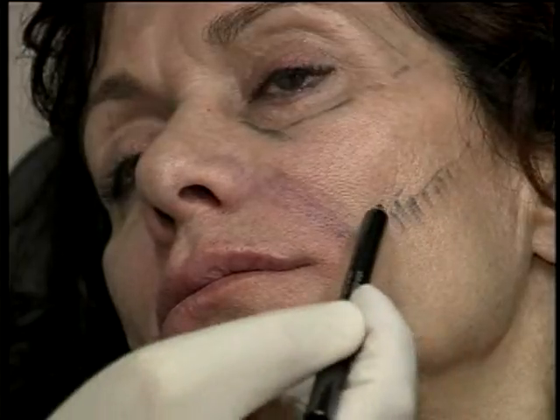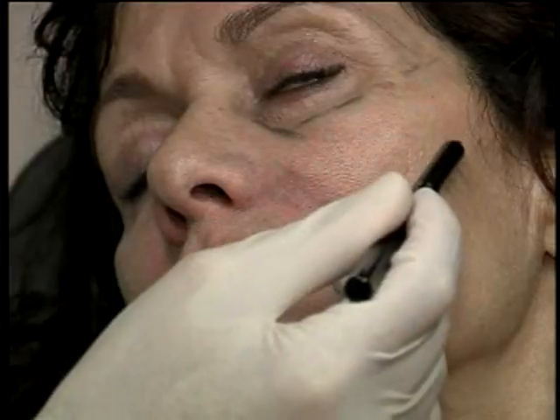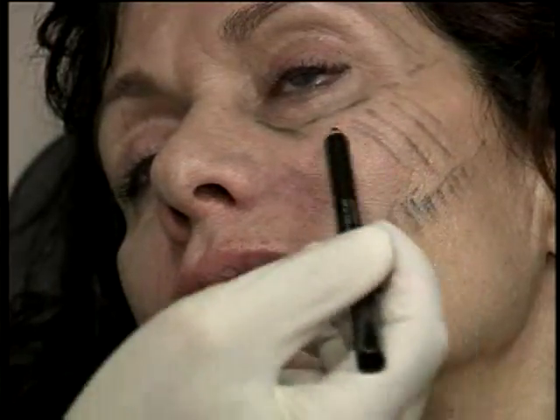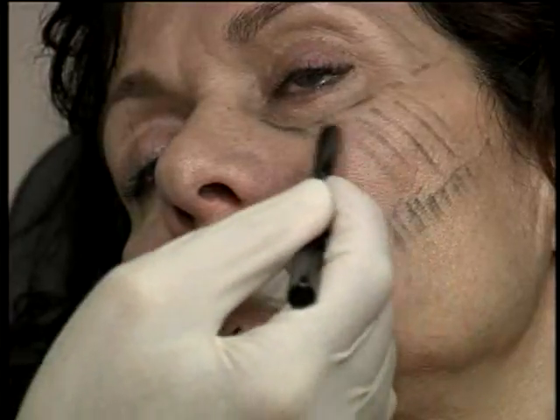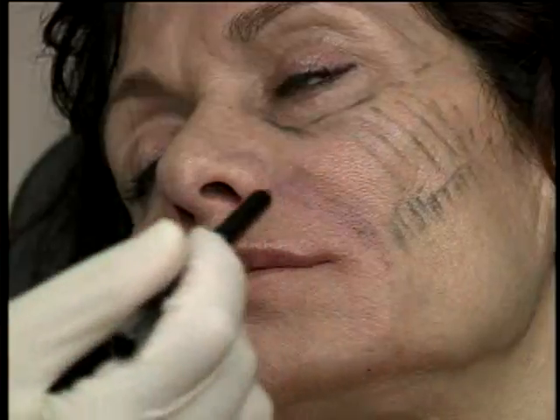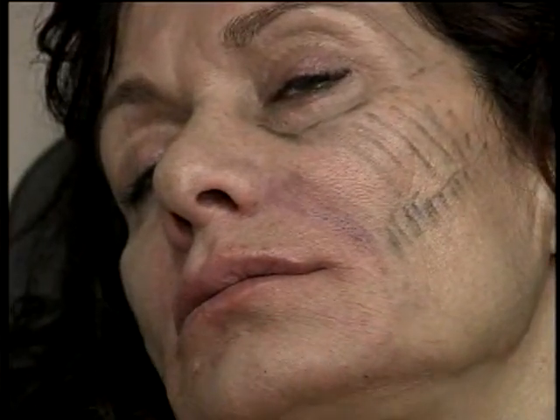You don't want to put too much product in here because it can get lumpy and not look good. But this area, we can replace some volume that's been lost in here. So that's an area to fill.